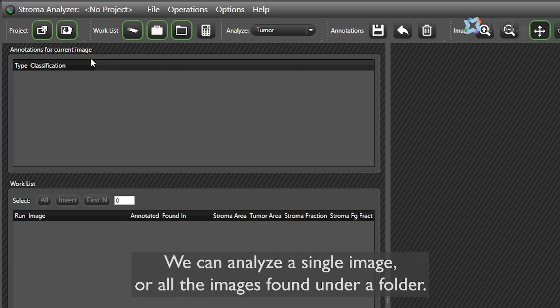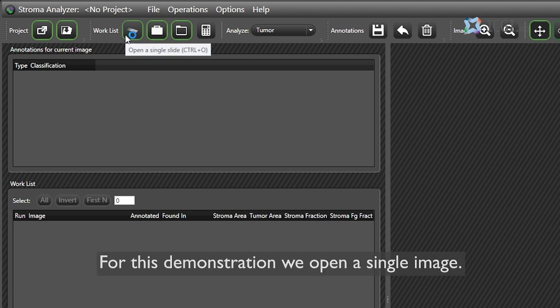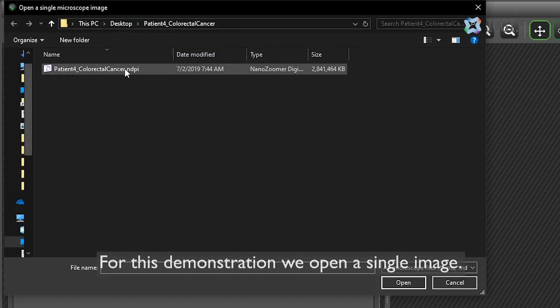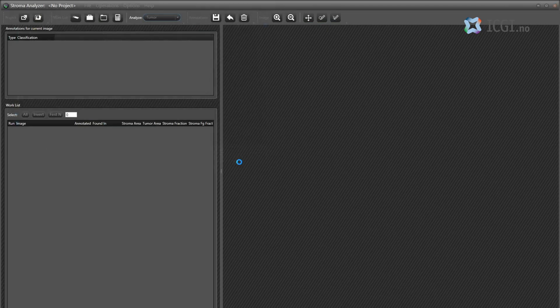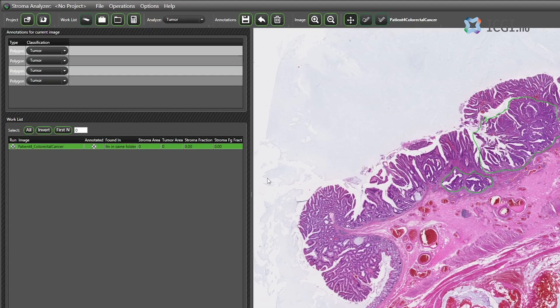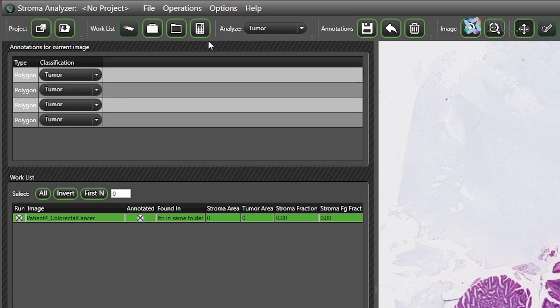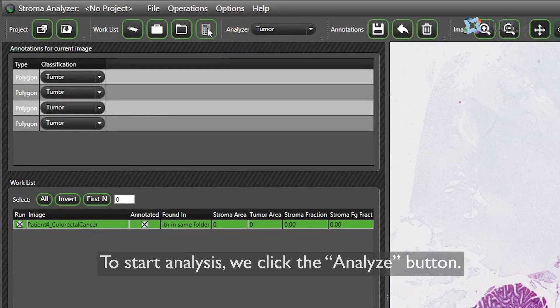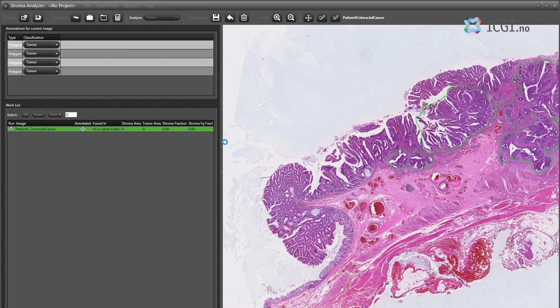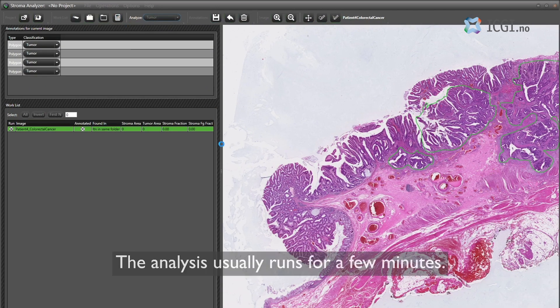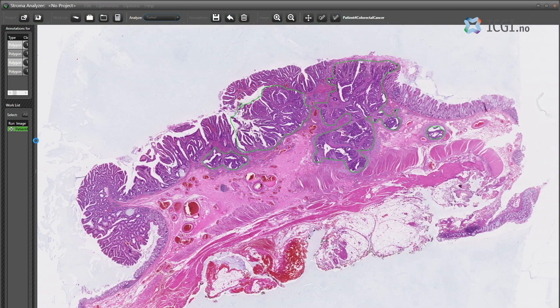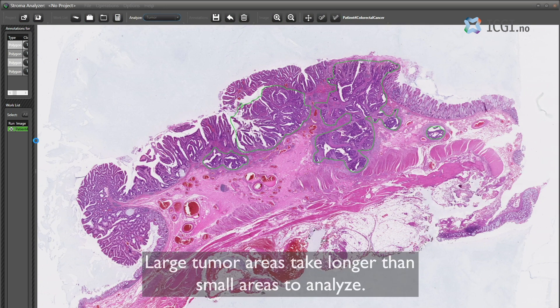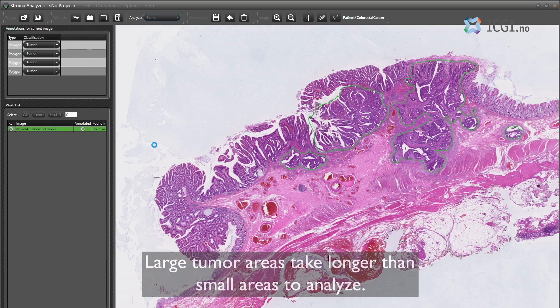We can analyze a single image or all the images found under a folder. For this demonstration we open a single image. To start analysis, we click the analyze button. The analysis usually runs for a few minutes — large tumor areas take longer than small areas to analyze.